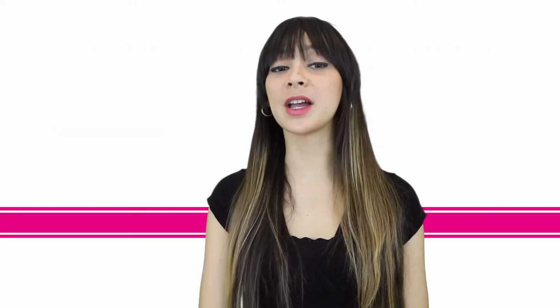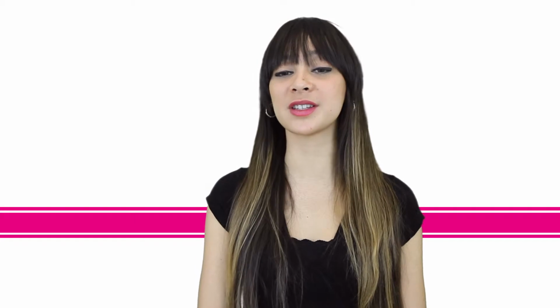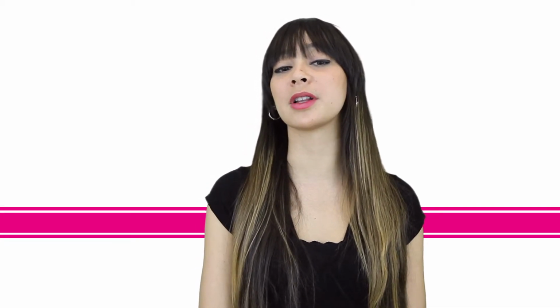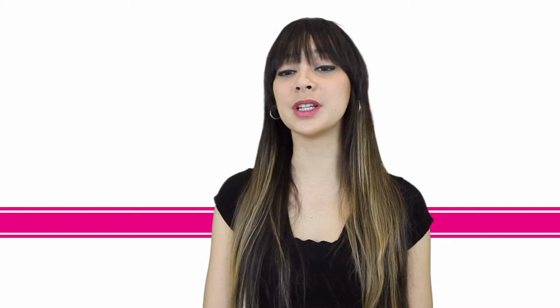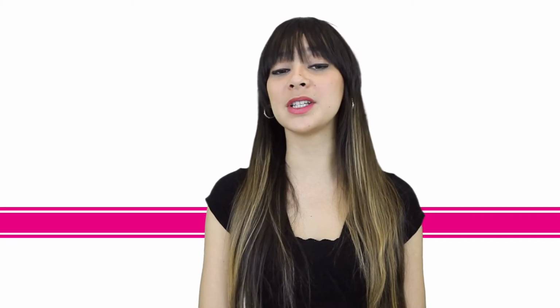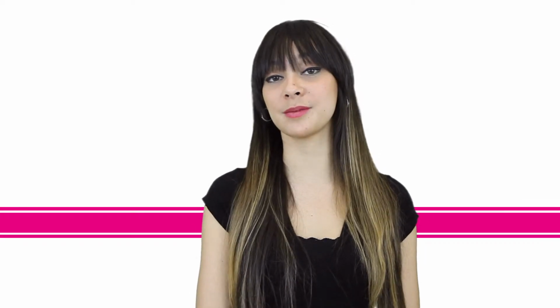What are the types of IUDs? There are two types of IUDs available for use, hormonal or copper. The hormonal IUD, such as Mirena, releases a form of the hormone Progestin into the uterus. This type of IUD can remain in place for at least 5 years. The other is a copper IUD and the most commonly used. A copper IUD, such as Paragard, has a copper wire wrapped around the stem of a T-shaped device which releases copper into the uterus. It can stay in place for at least 10 years.